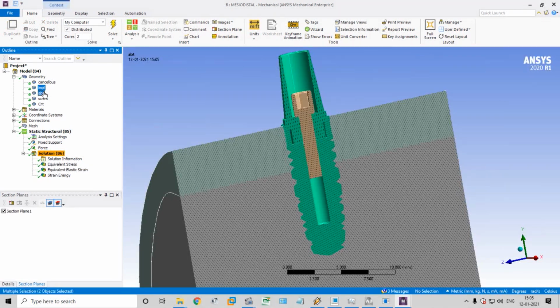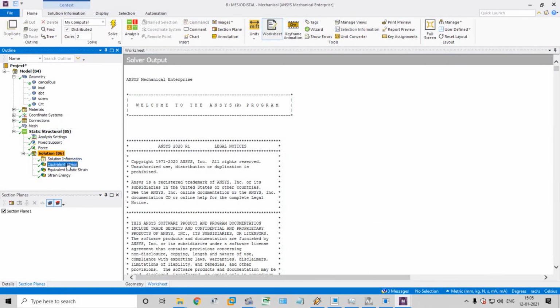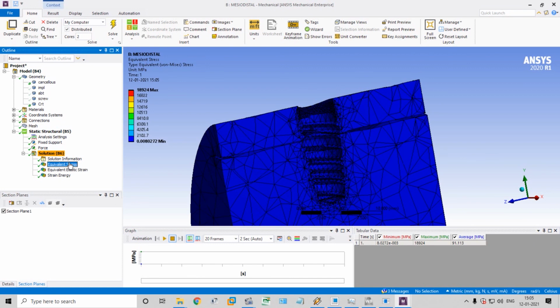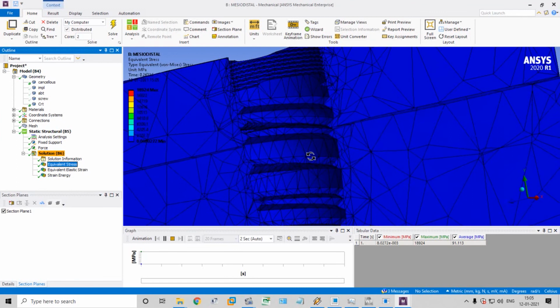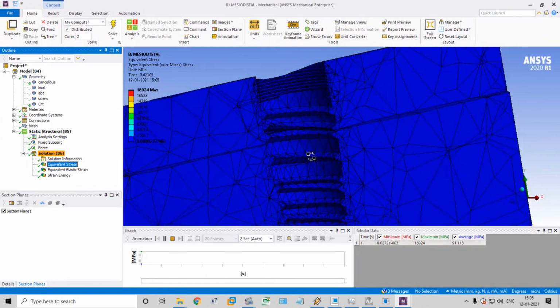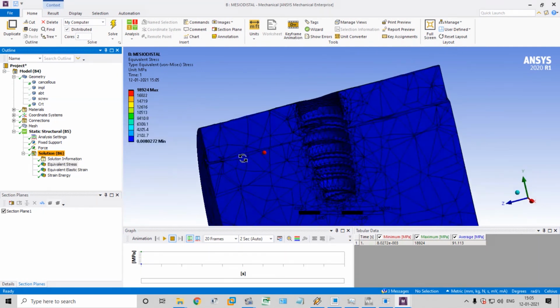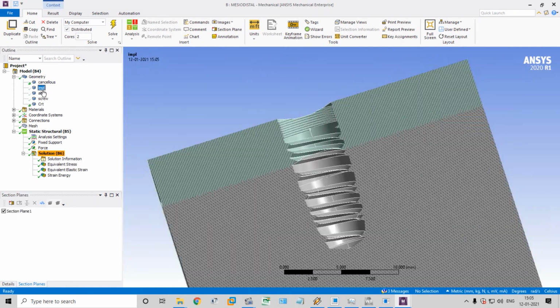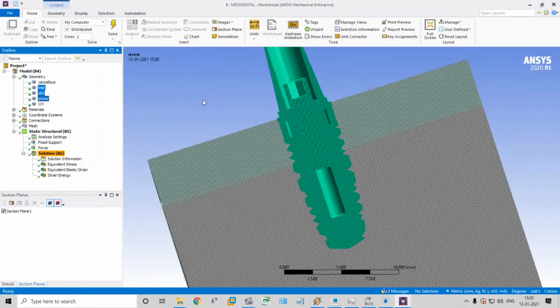Now we can hide the implant, abutment, screw. See the strain formation, especially stress in the bone. Okay. That's about dental FEA and implant. Show all bodies.